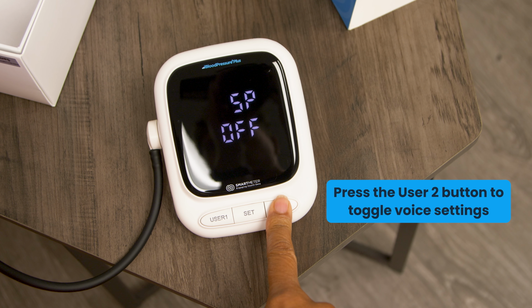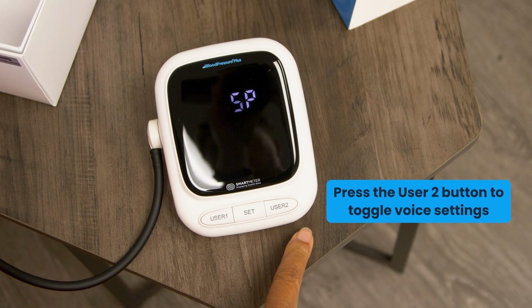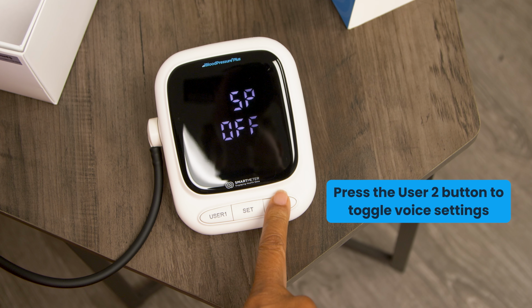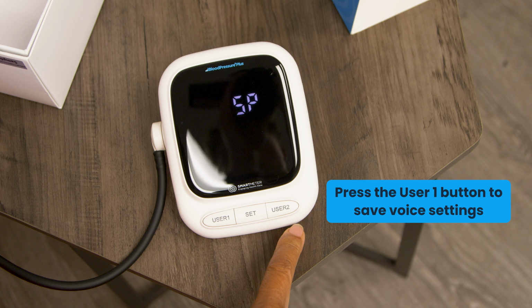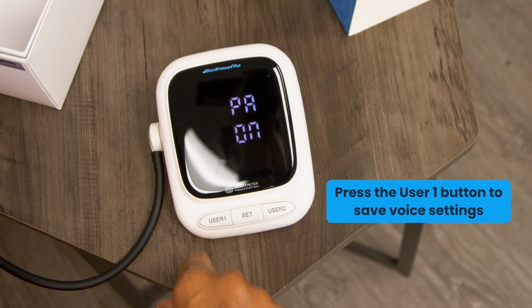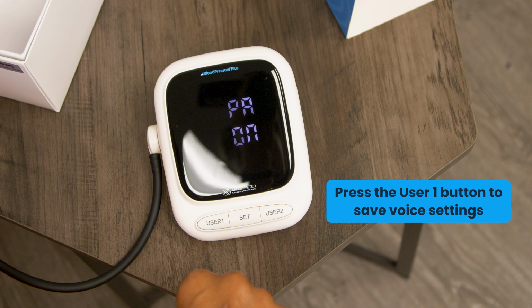To switch the voice feature on or off, press the User 2 button. Each press will toggle between off and on options. Once you've selected your desired voice setting, press the User 1 key to confirm and proceed to the next setting.